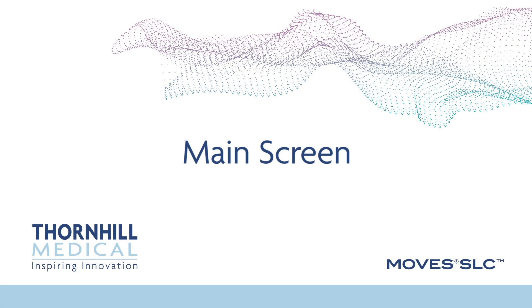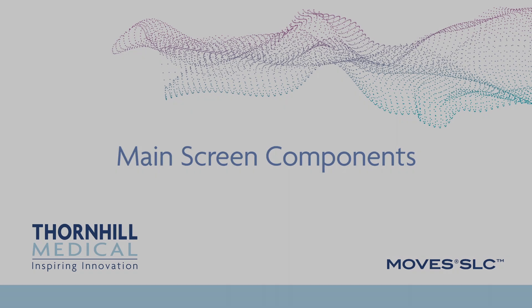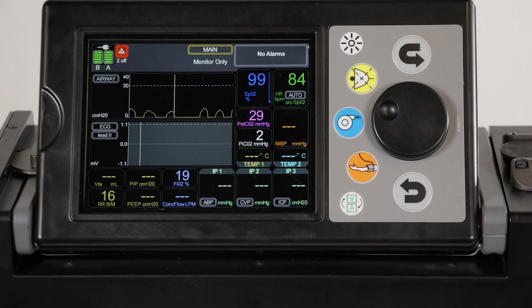The main screen is the primary screen of MOVES SLC and is used to display patient status and monitored values. If no button is pressed for a period of time, the system will return to this screen. The main screen displays patient status only and no functional settings can be changed from this screen. The main screen display shows the following: power status icon, screen view, alarm status, O2 saturation, heart rate, end tidal CO2.